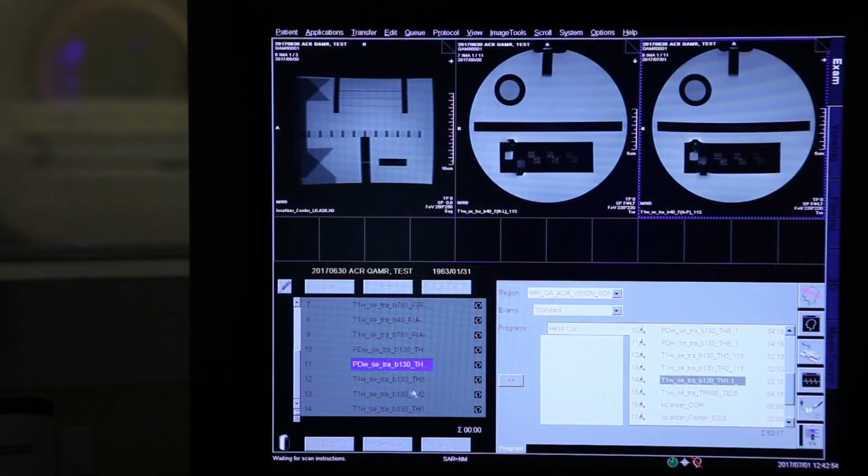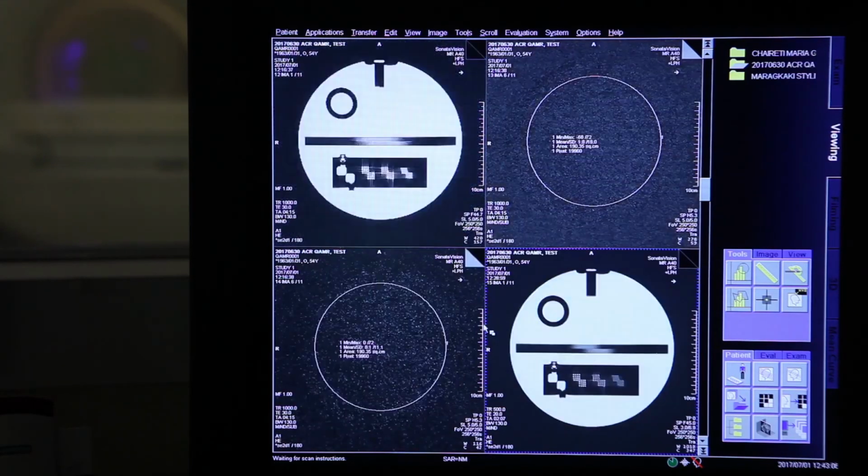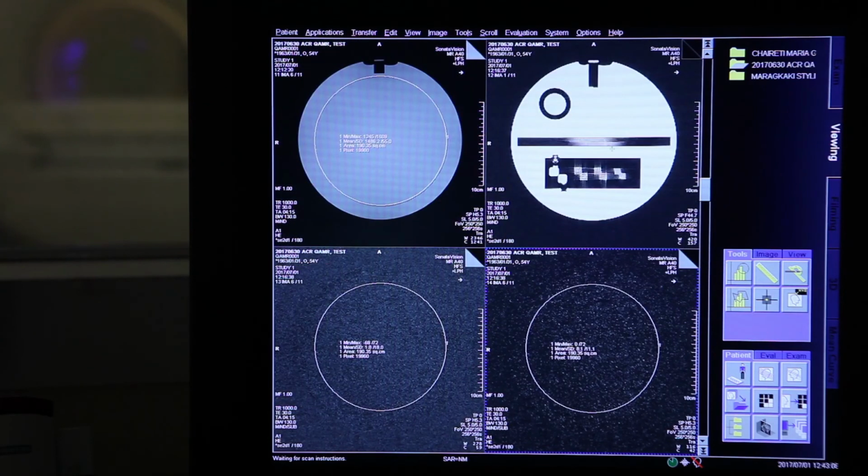We've taken all the slices, all the slice thicknesses, different thicknesses. Now we're going to check and see the effect of the slices. So let's start from the beginning, alright? This is the 5mm slice, right? The bright signal is from the ramps inside the phantom. Exactly. This is the method you actually use to measure slice thicknesses. So you use crossed ramps.